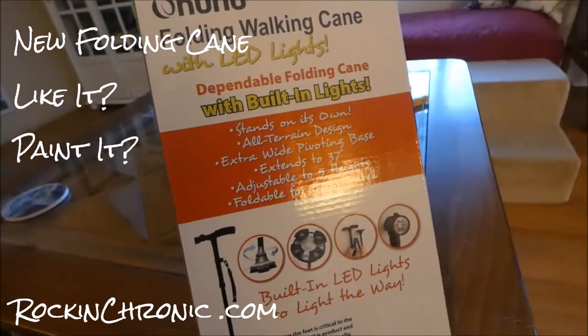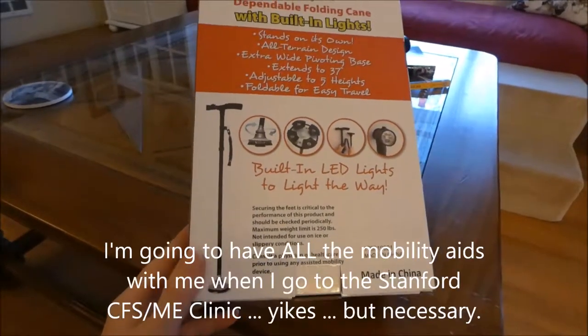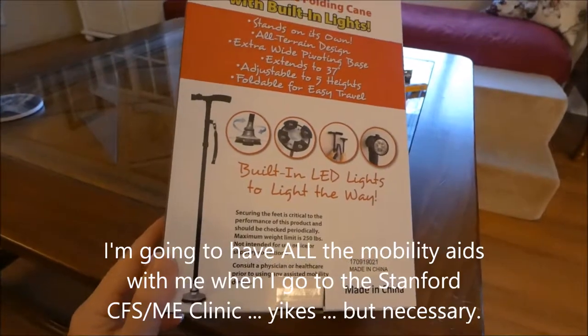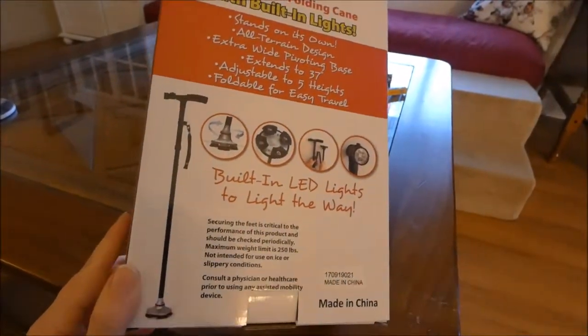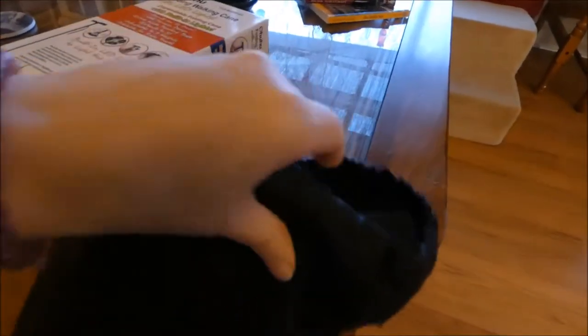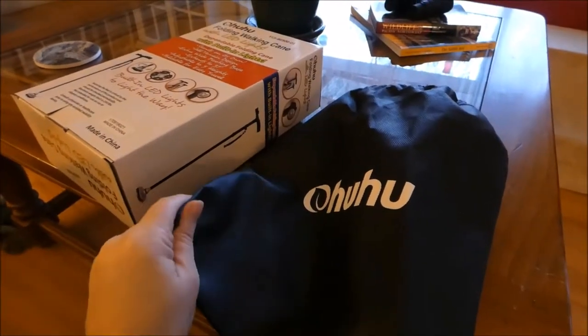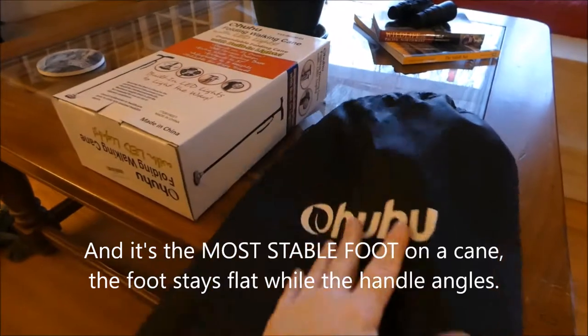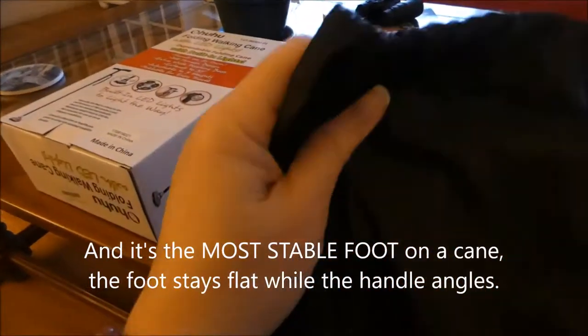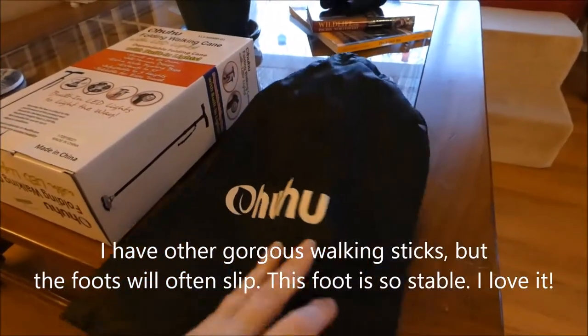A new folding walking cane arrived for my trip down to Stanford, and I figured I needed a little something to take with me that I could easily fold, and this is what I got. It wasn't very expensive. It came in a little bag with a little drawstring. I like that it came in a bag — it's a very cheap cloth bag, but it'll make it really easy for traveling and not having the bottom of the cane get other things dirty.